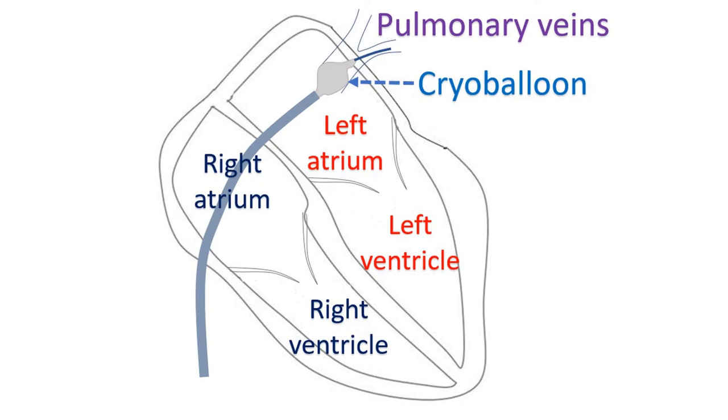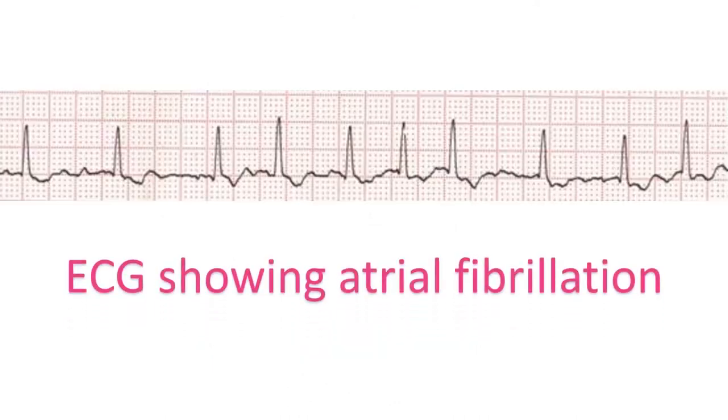As the cryoballoon produces uniform cooling around the opening of the pulmonary vein, the chance for missing a region of abnormal electrical activity is less. Moreover, it is more convenient as multiple ablations using a conventional cryoprobe is not needed. Atrial fibrillation is the commonest sustained heart rhythm abnormality, and the chance for atrial fibrillation increases as age advances.